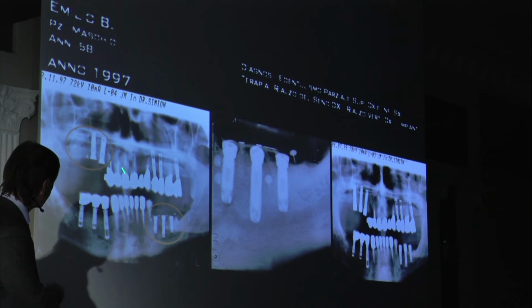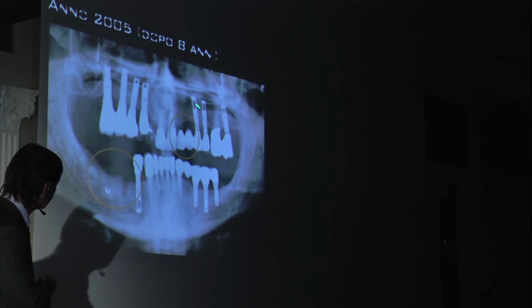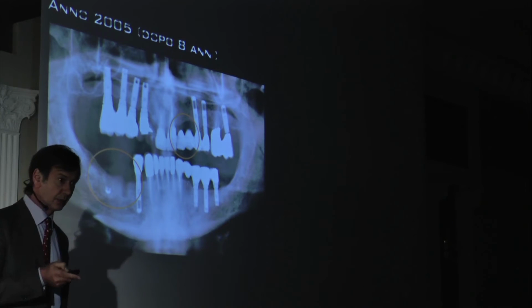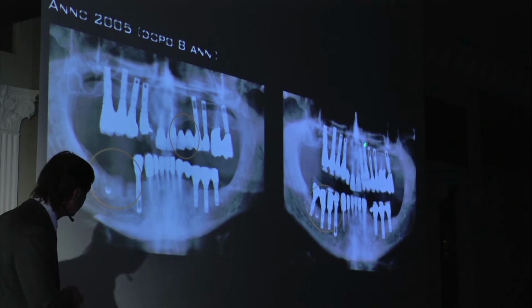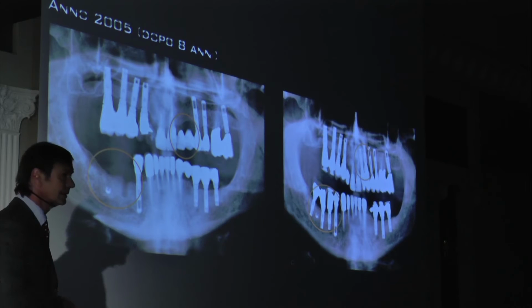Quickly, another patient. You see here, vertical augmentation, machine implant in 1997. Then the patient lost these implants and this bridge broke. So I placed 2 implants here and 3 implants here. And these are machine and these are rough.